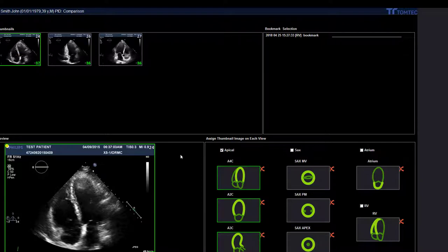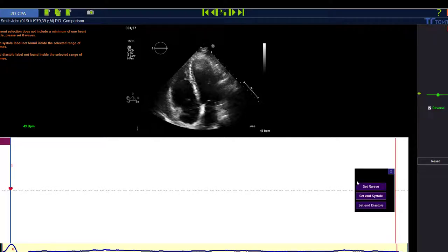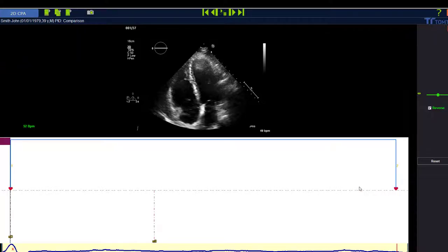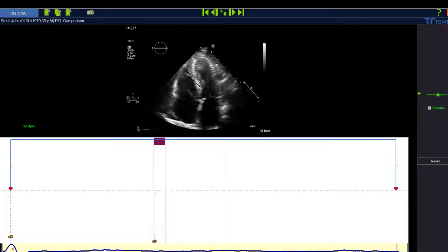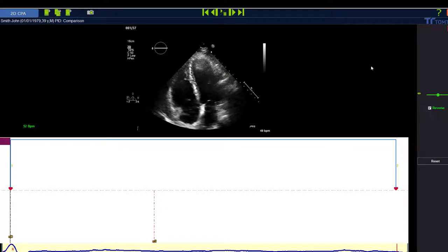In 2DCPA8, the workflow has changed. After loading the image, the software now forces you to check the timing. Instead of going to the M-mode and selecting the timing step optionally, you now really have to do it — the first thing before you can draw the contour is to check the timing.